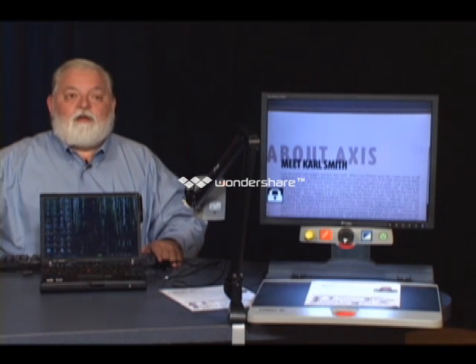It's much easier. Now, frankly, I don't think it's as big a problem as it used to be, because these cameras have what's called a good depth of field, meaning they stay focused even if you move a little bit closer or a little bit further away. The focus isn't anywhere near as tight as it once was. So it's not as big a problem, but that can be an issue, so you can turn that thing off.